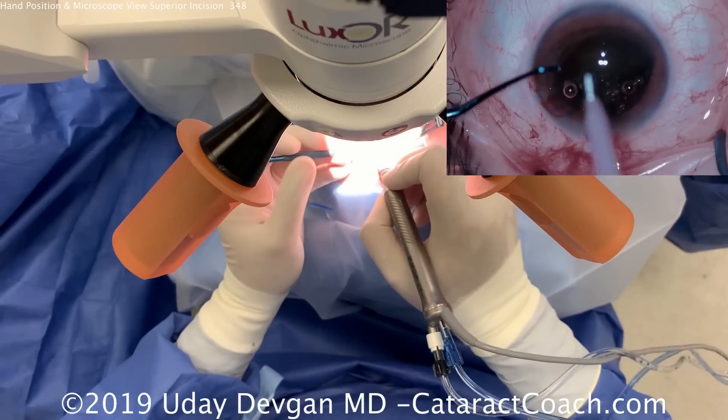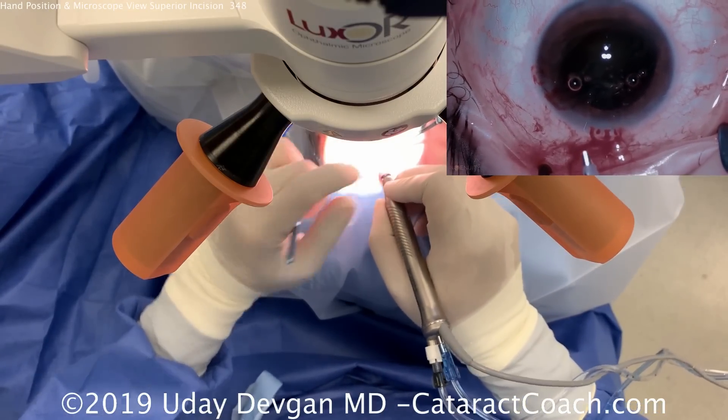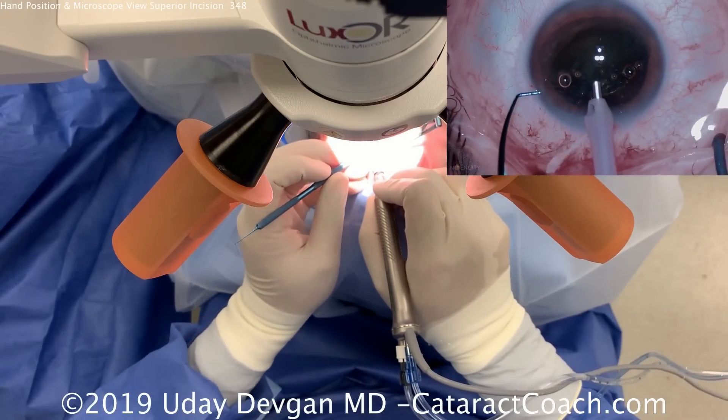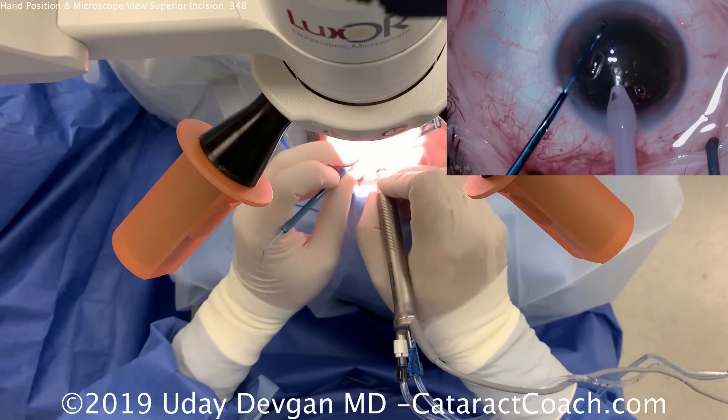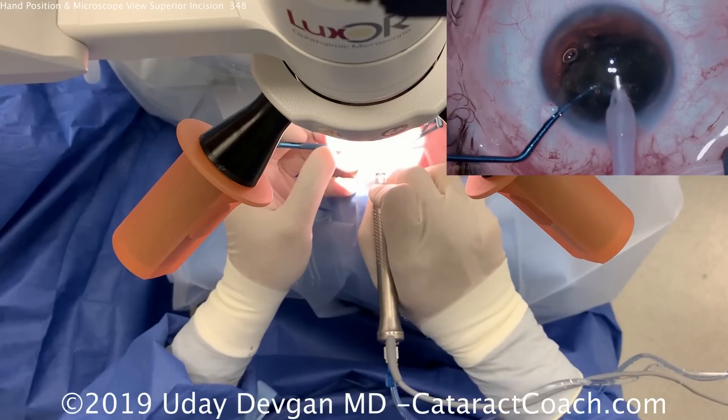The chopper goes into the left hand, held like a pencil. The FACO probe is in the right hand, adjusting the FACO tip. Both hands are holding instruments like pencils. Buzzing with the FACO probe, we get a quick chop at the beginning and break the nucleus into two halves.